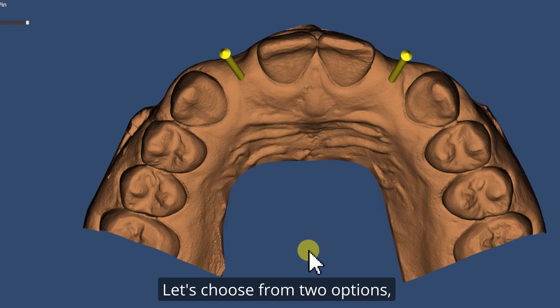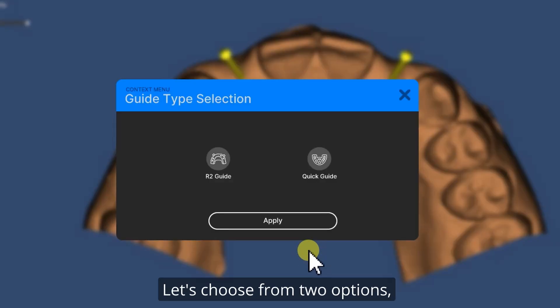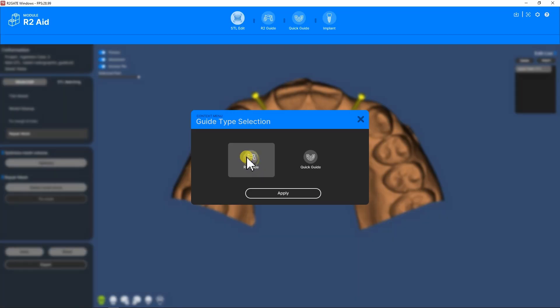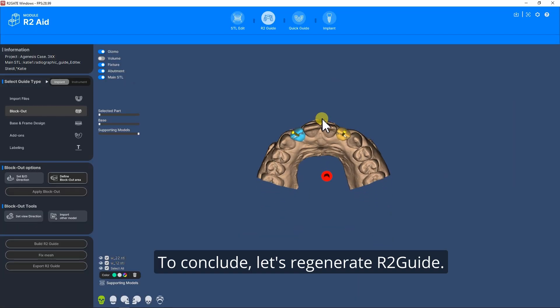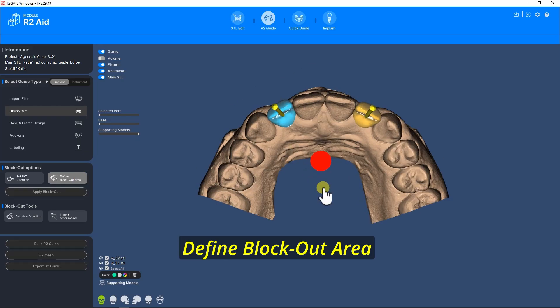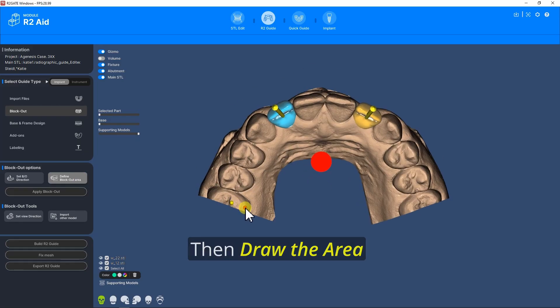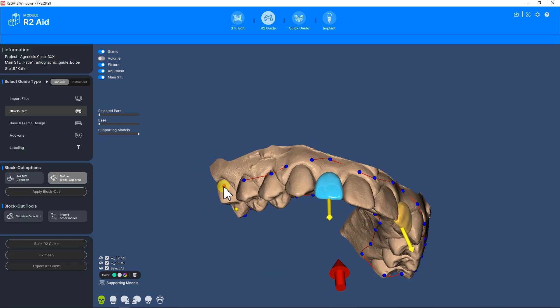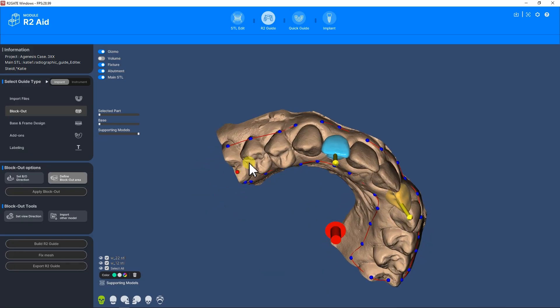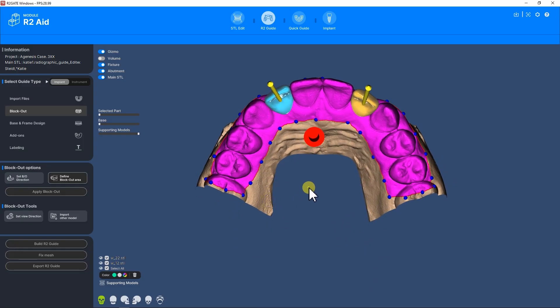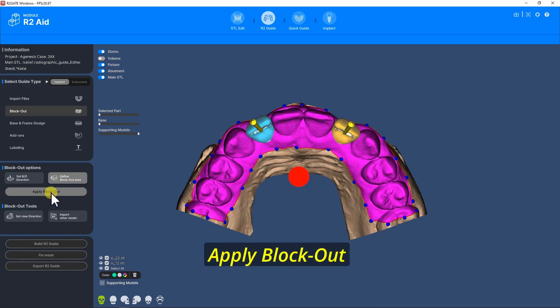Let's choose from two options. For this case I'm selecting R2 Guide. To conclude, let's regenerate the R2 guide. Let's press Blockout, Set Blockout Direction, Define Blockout Area, then draw the area. Set Blockout Area, then draw the area. Apply Blockout.